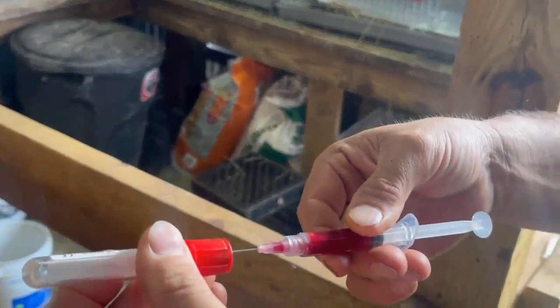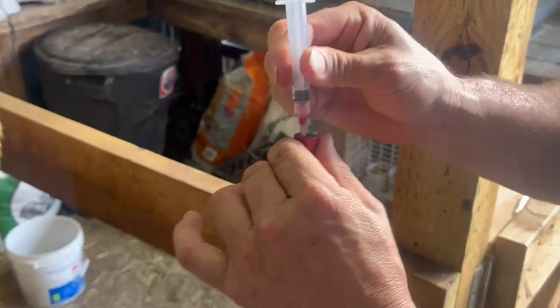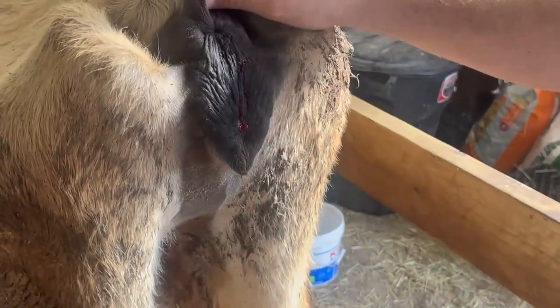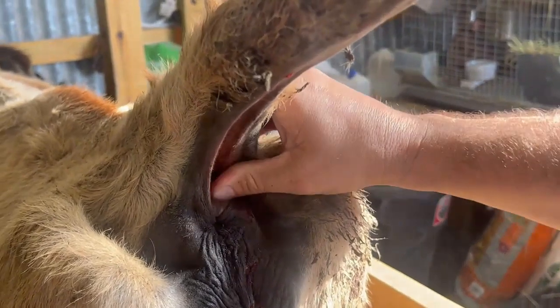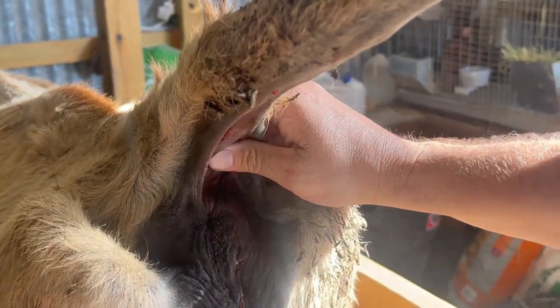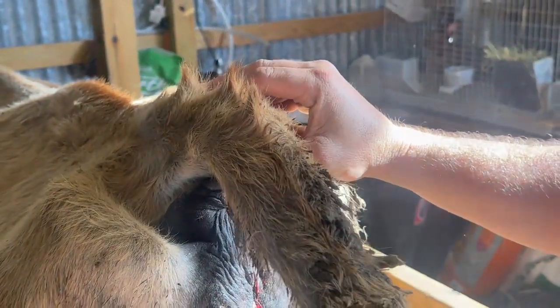We are going to put it in the test tube right here. Stick it in and it automatically sucks the blood in. Pull it out and we're done. Then quickly I want to lift the tail back up and press here just to stop the bleeding and make sure she's good. And that's it — I'll clean her up a little bit. After that we send this off and we'll know in a week whether or not she's pregnant.